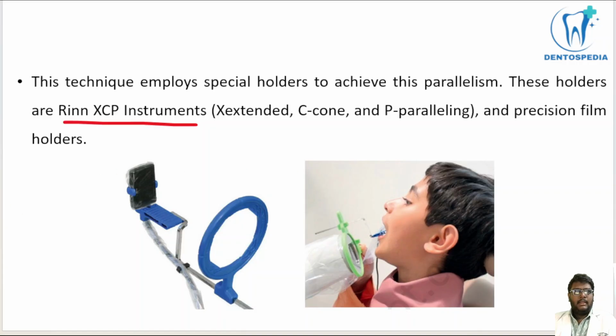Okay, and when compared to the bisecting angle technique, the paralleling technique gives much more information with clarity and good images. We will get more resolution and fewer errors in this technique when compared to the bisecting angle technique.